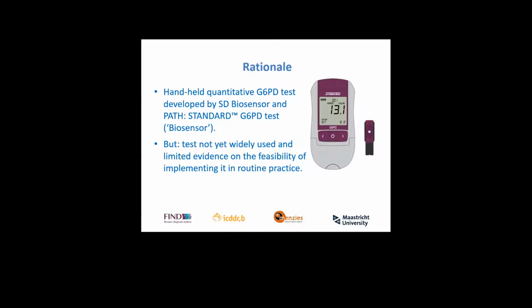So handheld quantitative G6PD tests have been developed by SD Biosensor and PATH. The Standard G6PD test is a good device, but the tests are not yet widely used, and there is limited evidence on the feasibility of implementing it in routine practice. Next slide, please.